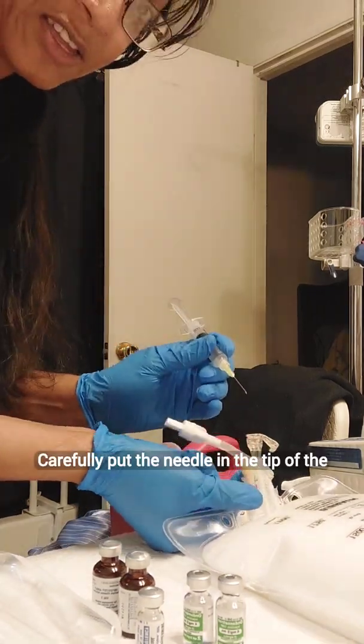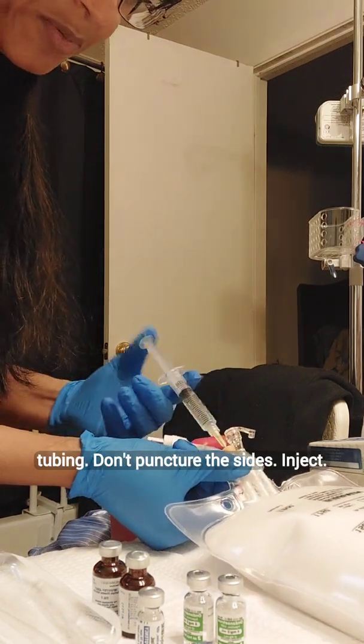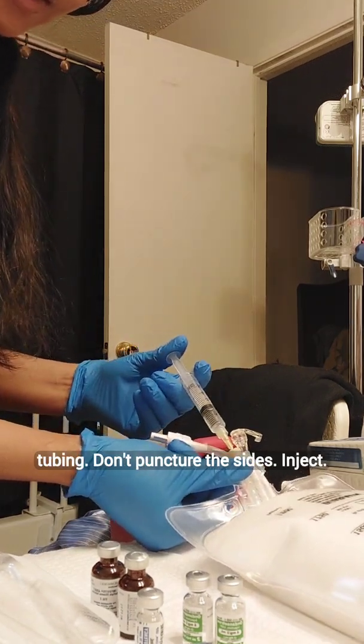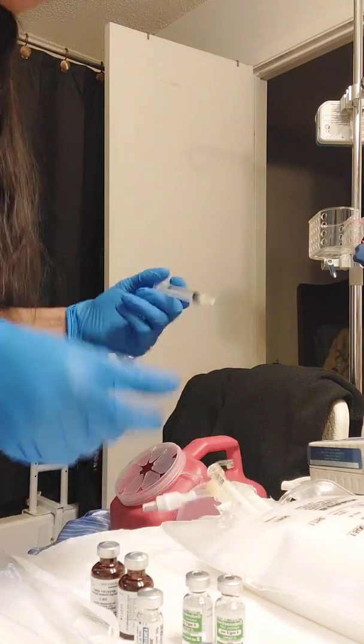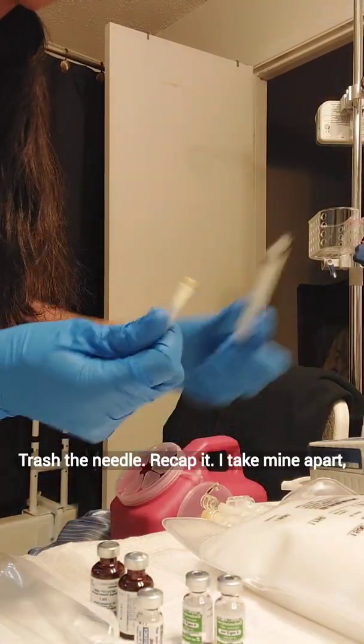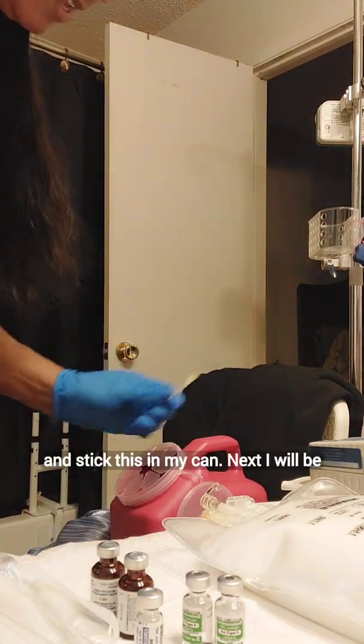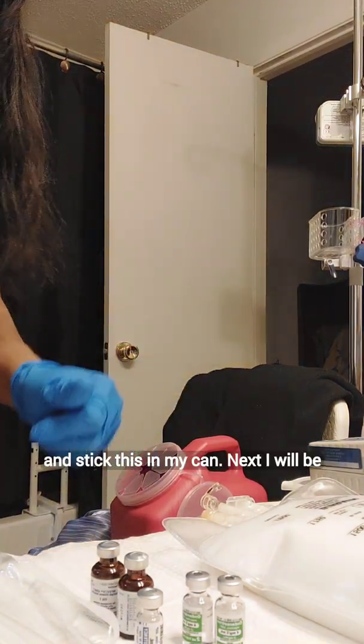Carefully put the needle in the tip of the tubing — don't puncture the sides. Inject it, trash the needle, recap it. I take mine apart and stick it in my can.